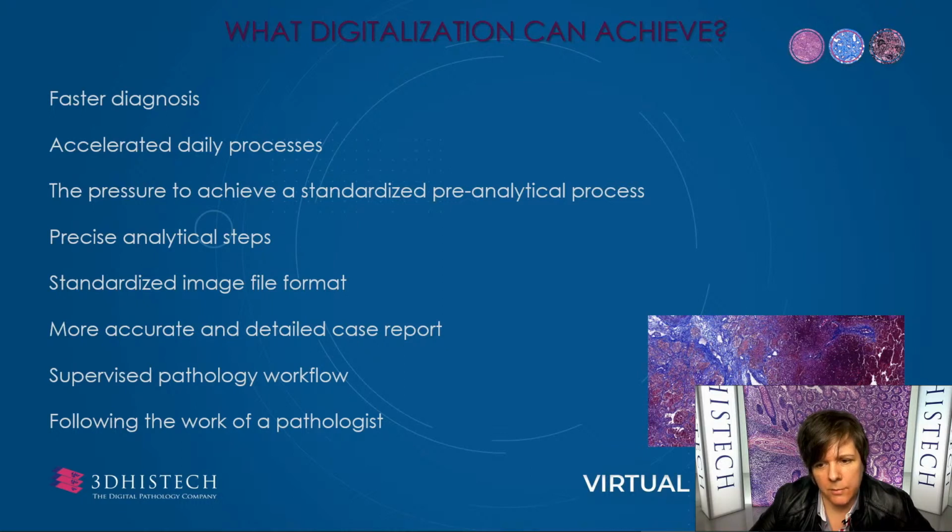I must also mention the image format, as each manufacturer has its own. However, diagnostic use will result in all manufacturers using the common image type, which will be DICOM. The result of this process is standardization.